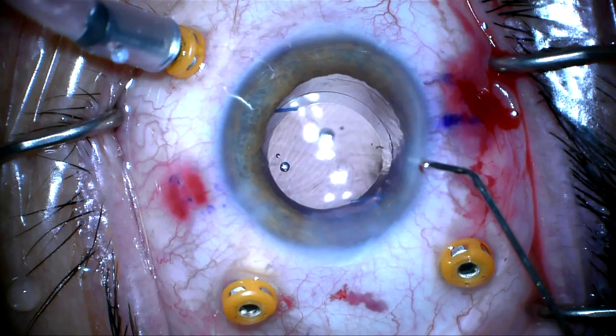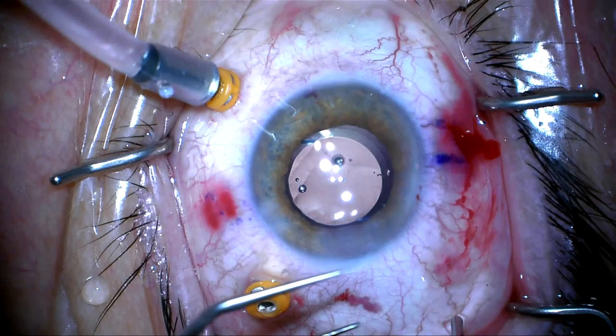The trocars are carefully removed and conjunctiva is brushed down over the scleral opening. The case is completed. Thank you for your attention.